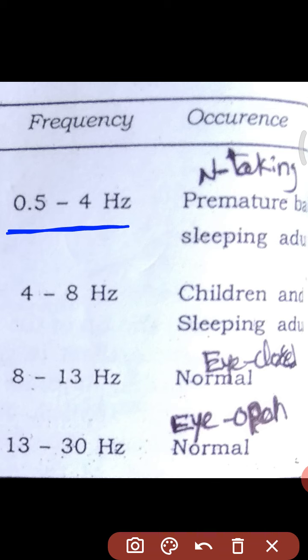The first one is the delta wave, and the second one is the theta wave. The theta wave frequency range is 4 to 8 hertz. When children and adults are sleeping, we need to generate the waveform. So we have to see the previous one.